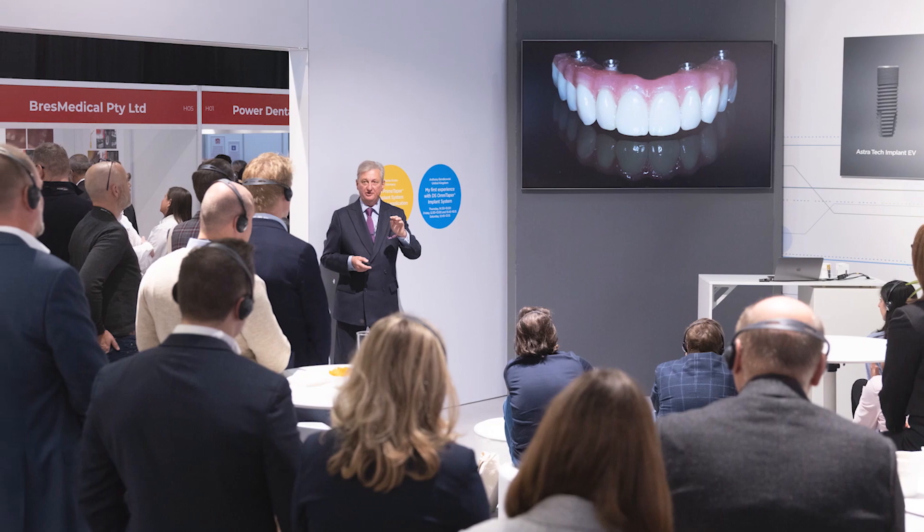One of the great advantages of the Omnitaper family of implants is that it comes ready delivered with a temp base. That means at the time of surgery, if you wish to go for an immediate non-functional temporary, you've got that facility very easily and very straightforwardly — a major advantage with the Omnitaper implant.